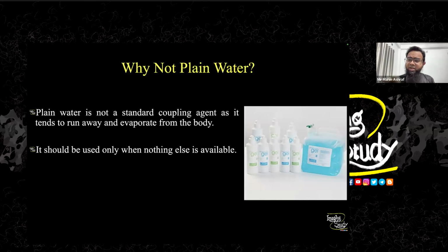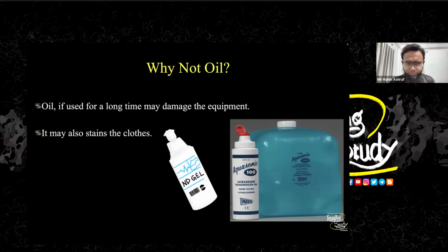But it can be used when the gel is not available. Like, I'm giving you a tip. When a patient comes to me and I have to do an oral ultrasound, sometimes if the patient is a baby, I just put a slip of water over the transducer surface and then I put it over the tongue. That will be very simple. So you can use water over this surface, but it's not commonly used.